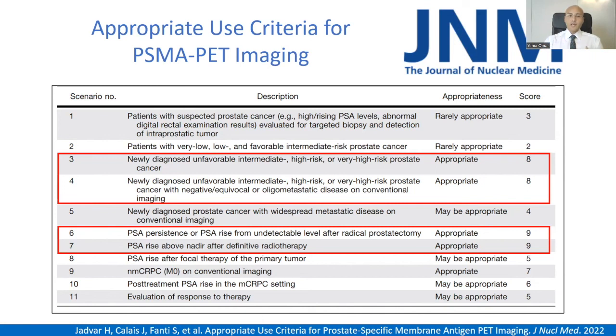And I feel that for the past 1 year or 2 years, the referrals are increasingly asking for PSMA PET-CTs. Our oncology and our urology have been adopting it greatly the past period, and they are seeing much accurate staging of the patients, and hopefully, again, as I said, better patient outcome. So now that's the PSMA PET-CT, and that's the indication of it.